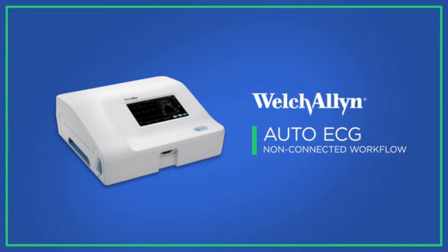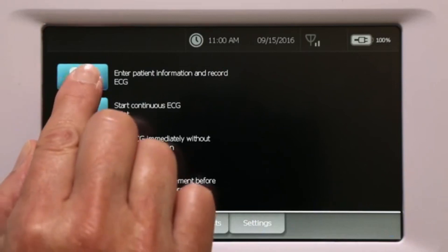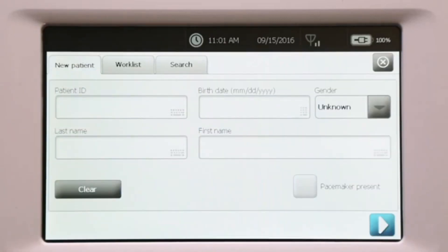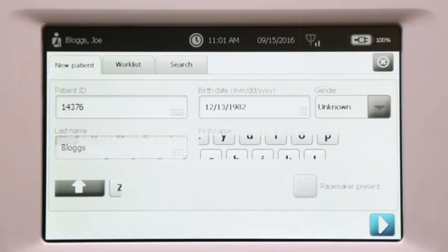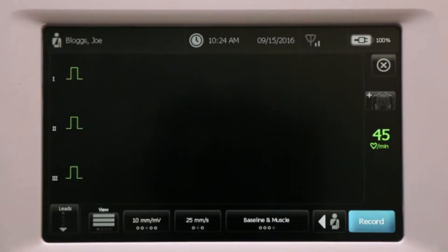In a non-connected environment, patient demographics will need to be entered by the clinician conducting the test. To initiate an ECG test, touch the Auto ECG button and the patient information screens appear. Enter patient information to prepare for the test.